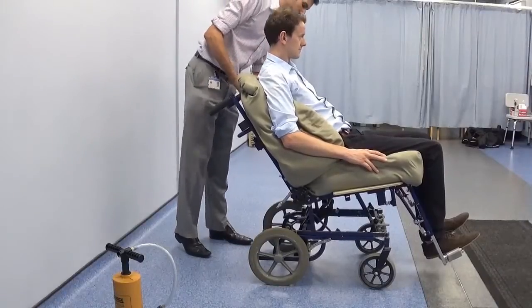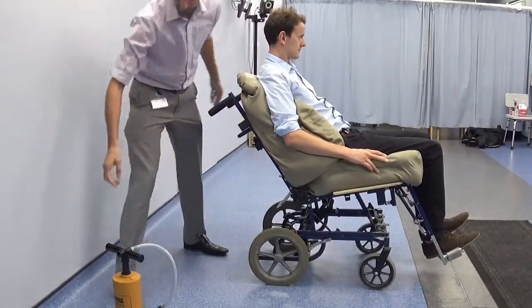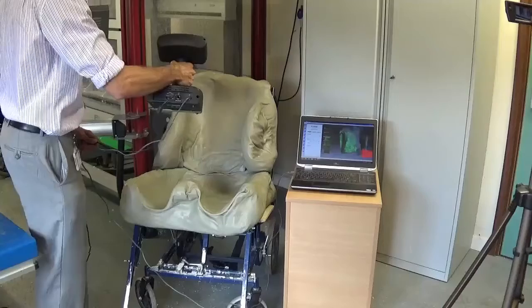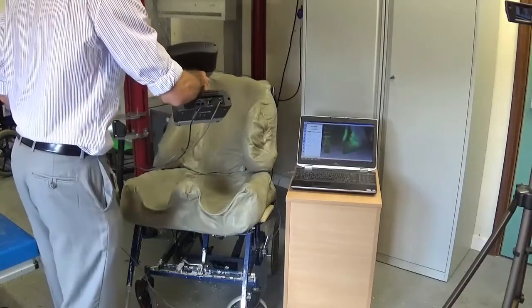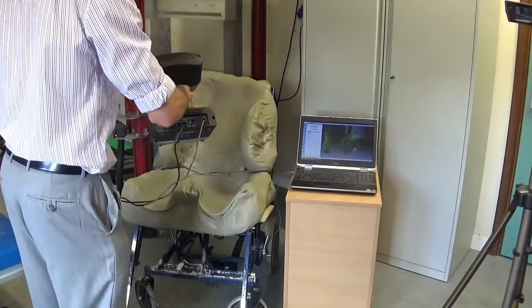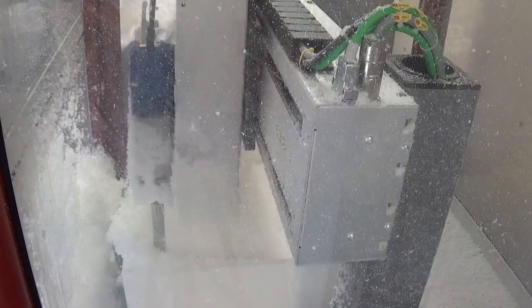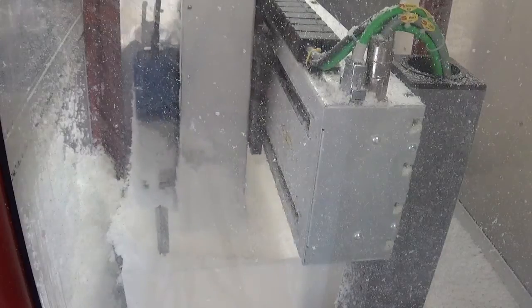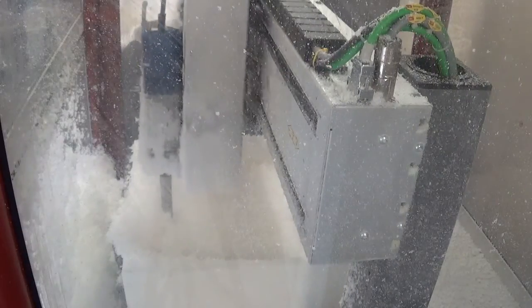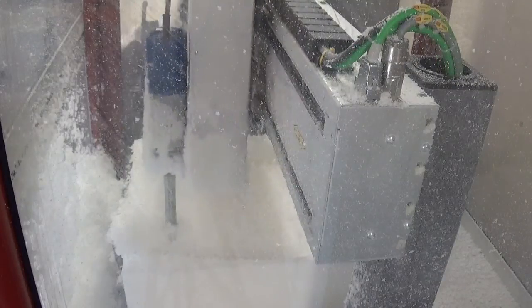Special vacuum bags filled with beads are used to form a cast of the client as they sit in a corrected position. A scan is taken of the cast using a white light scanner to create a digital version of the desired shape. Computer aided manufacture is then used to cut out a foam block to the shape of the original cast. It takes about an hour for the machine to cut out the shape of the seat.